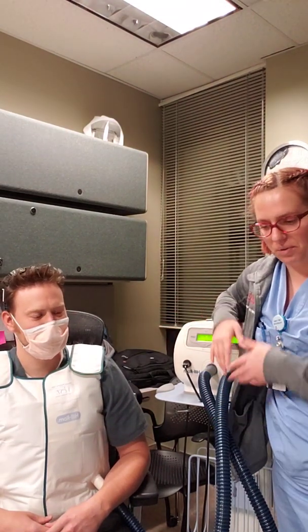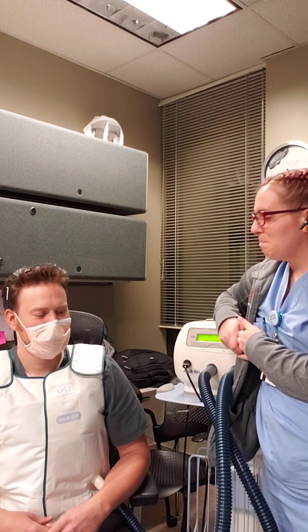So we'll pause that. You can pause it and resume it if your patient needs a break for some reason. And then once it's done, make sure your patient is in a good, clean, safe position. Help them with coughing, monitor their vital signs, and continuously monitor your patient for the whole 20 minutes.